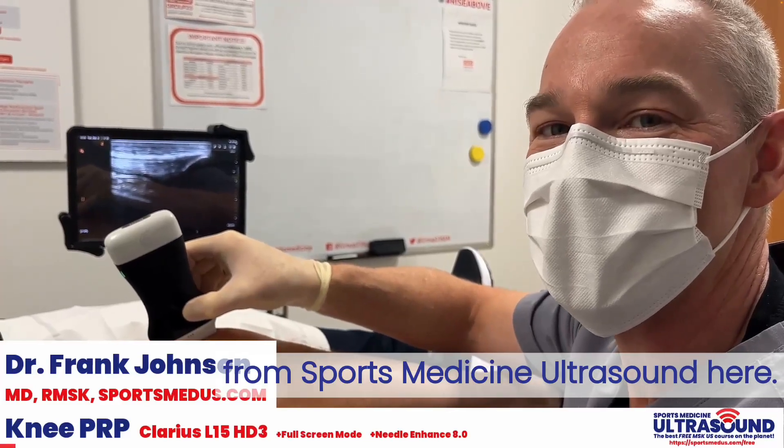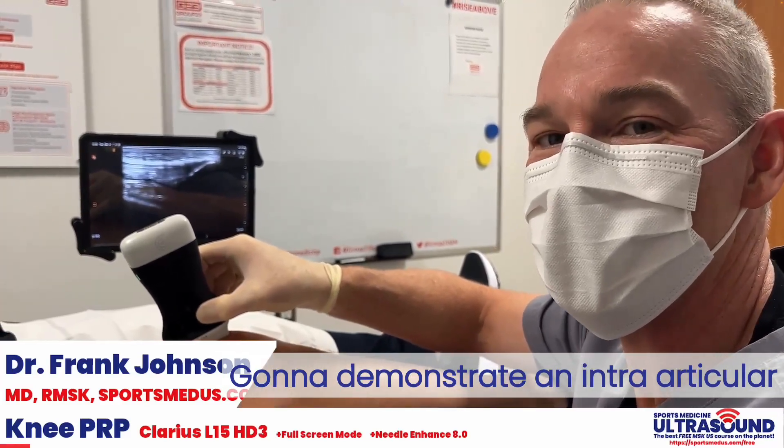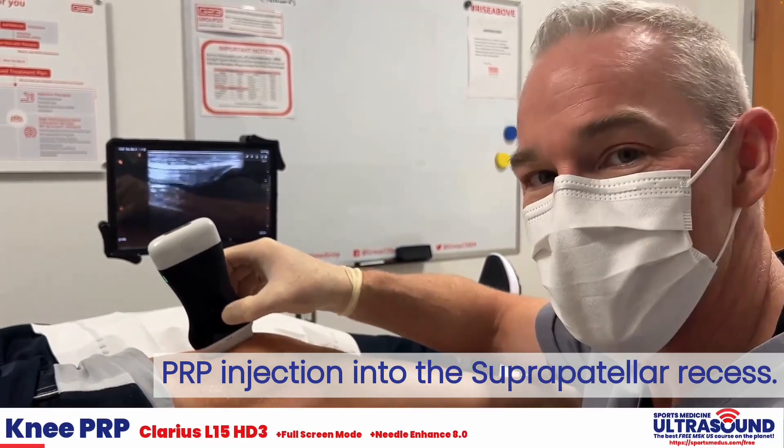Dr. Frank Johnson from Sports Medicine Ultrasound here, going to demonstrate an intra-articular PRP injection into the suprapatellar recess.